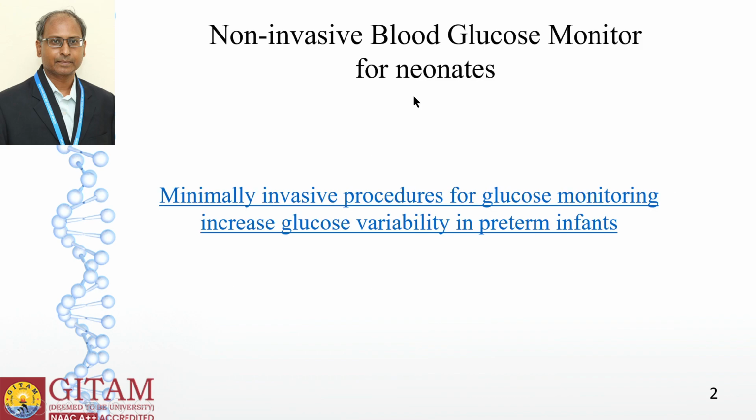The current methods for measurement of glucose in blood are invasive or minimally invasive, and they can lead to trauma. So we would prefer to have methods that are non-invasive. Non-invasive means that you do not puncture the skin.